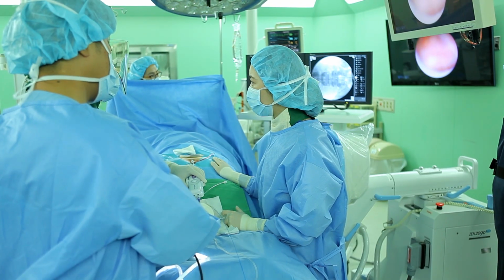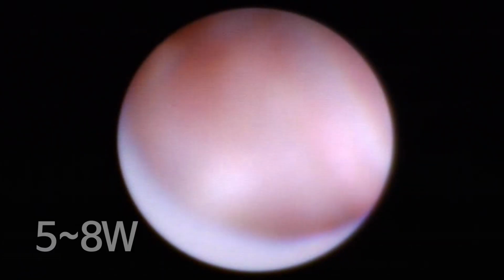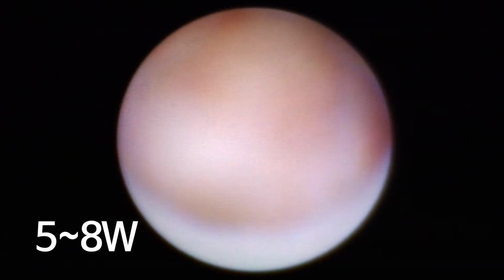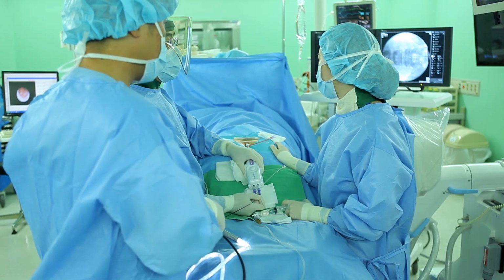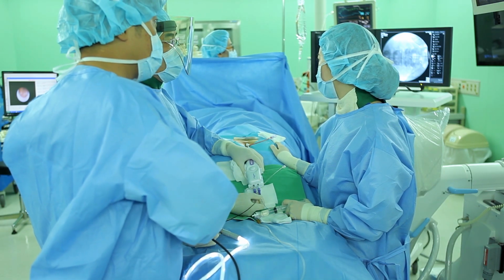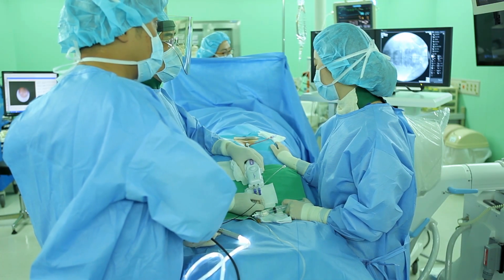Now, it's real laser treatment. After you are sure of the target point by stimulation, you may start lesioning at 5 watt and increase the laser power up to 8 watt for lesioning, as long as the patient does not complain of either severe leg pain or muscle contraction during the laser firing. If the patient complains of severe leg pain, you should doubt wrong placement of the laser fiber and be required to adjust the laser fiber.